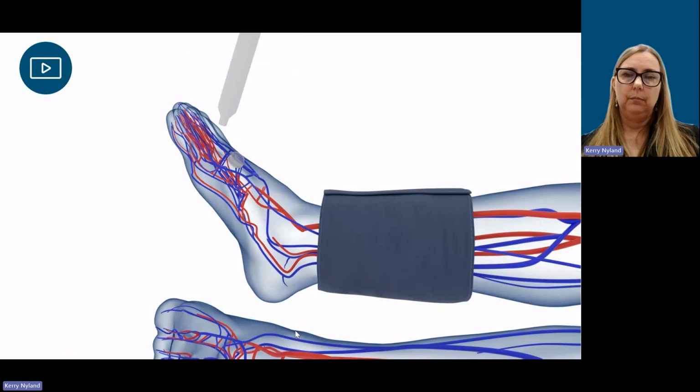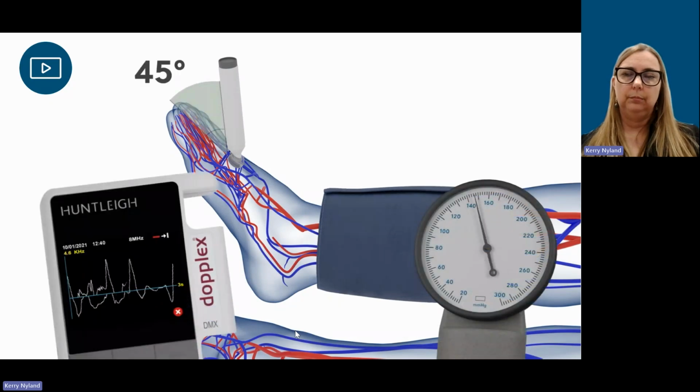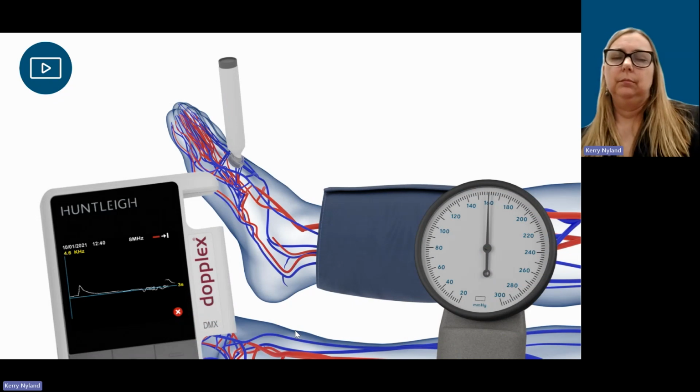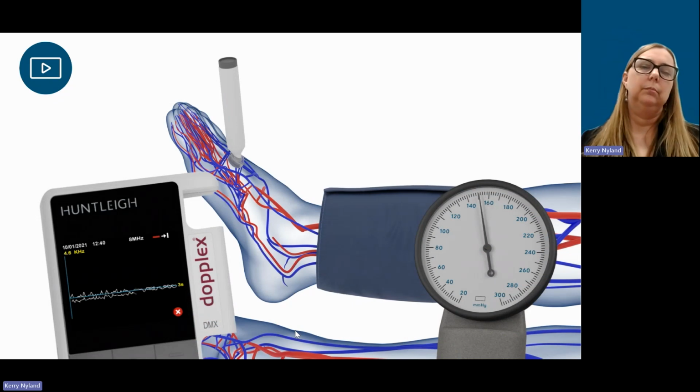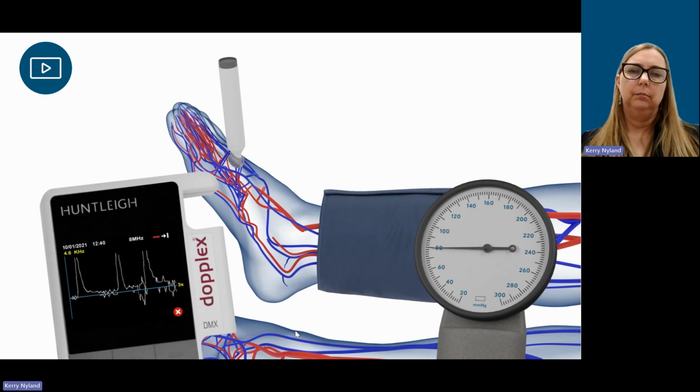Gel is applied and then using the Doppler probe, locate the dorsalis pedis artery and optimize the signal, holding the probe at about 45 degrees to the skin. Keeping the probe still, the cuff is inflated until the sound disappears, and then slowly deflated until the sound returns. This is the ankle systolic pressure and should be recorded.